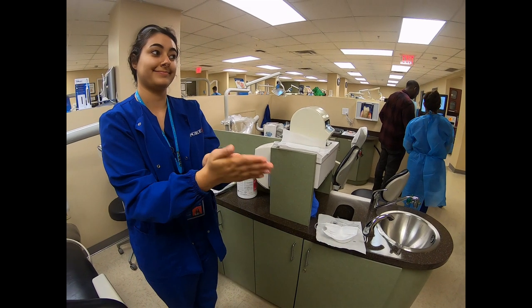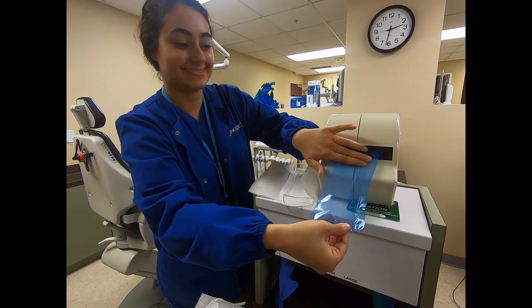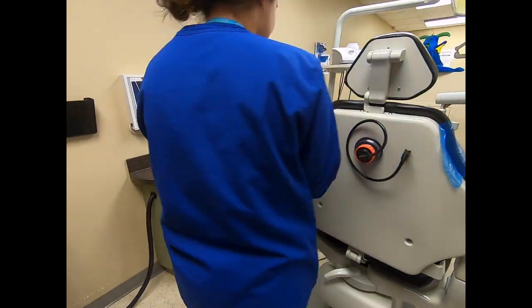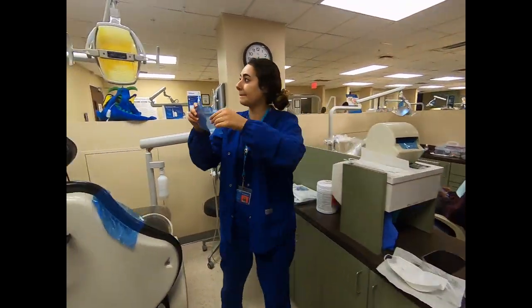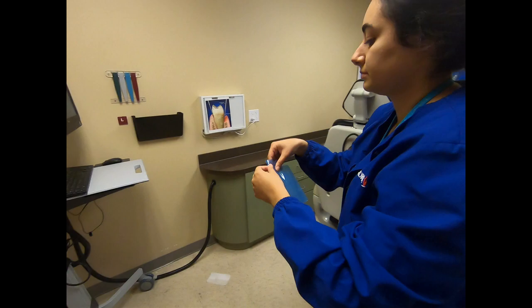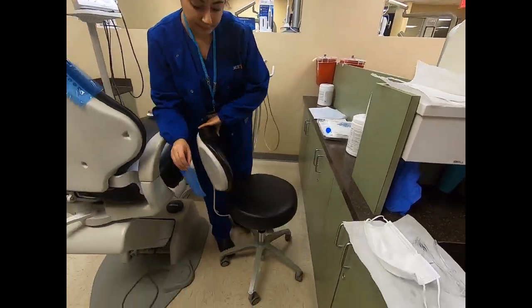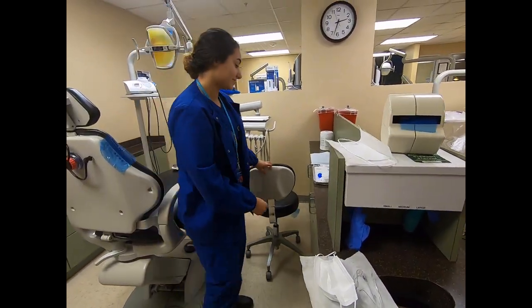To prepare the operatory for patient treatment, we will need to apply barriers for proper infection control. Apply the barriers with clean, bare hands to all of the following items. The chair buttons, light switch, mouse, and chair lever should all be covered with a piece of blue tape. The remaining barriers can be found within the contents of the burrito.